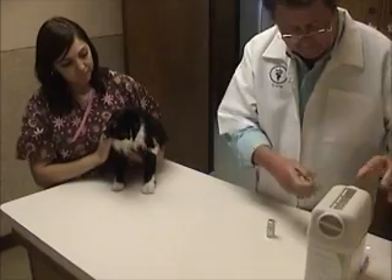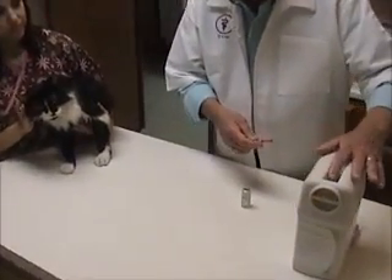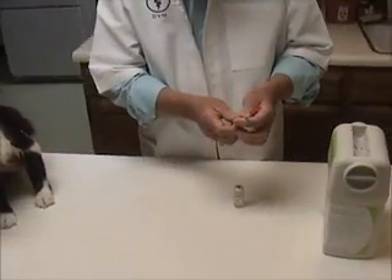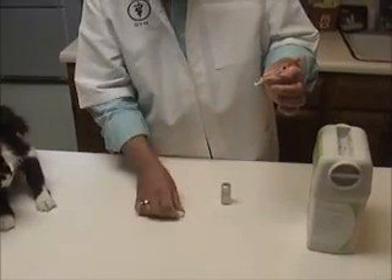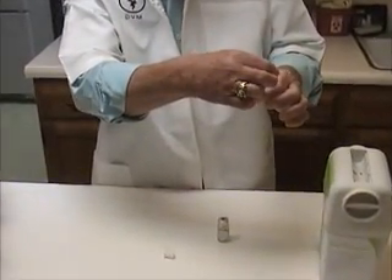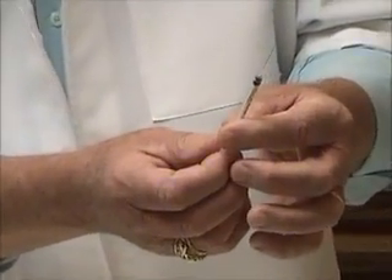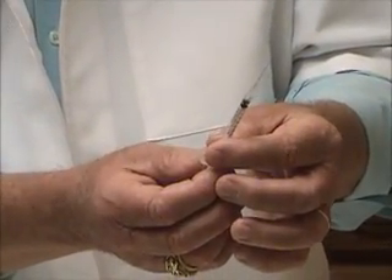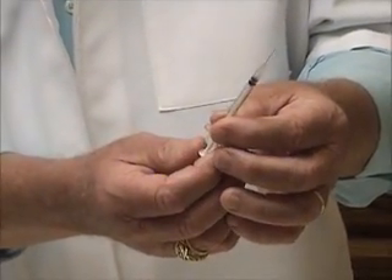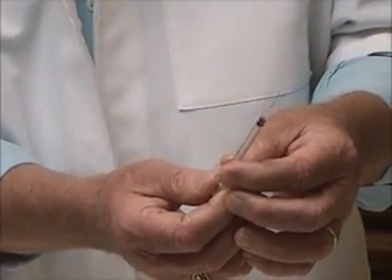The syringe has been taken out from the package here. This also has a nice little disposal thing for when you're done delivering the medication. You pull this tip off — of course it has a little plunger in the end. Take the tip off. It's an extremely fine needle, not much thicker than an actual hair.